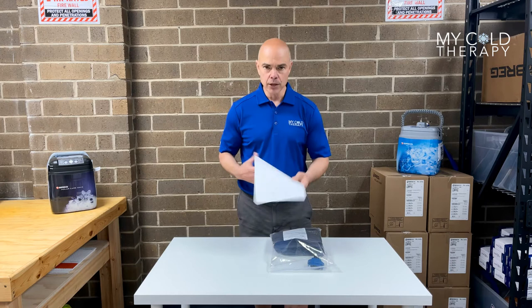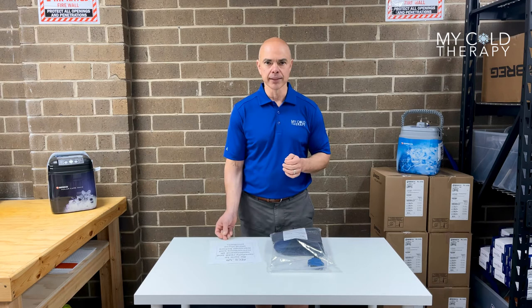In the box, you're going to get the instructions — please read all the instructions and warnings. And now we're going to talk about the dimensions of the pad. These are the dimensions for the Breg Polar Care Wave Large Knee Pad.